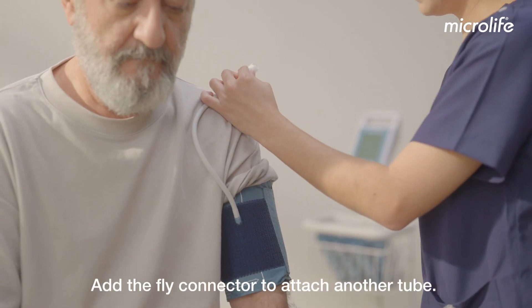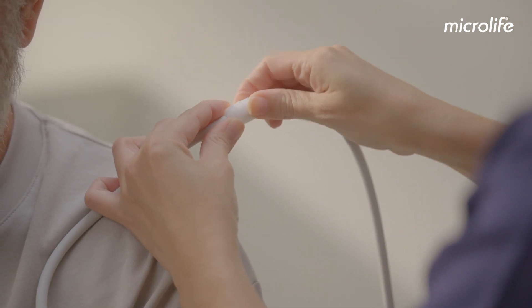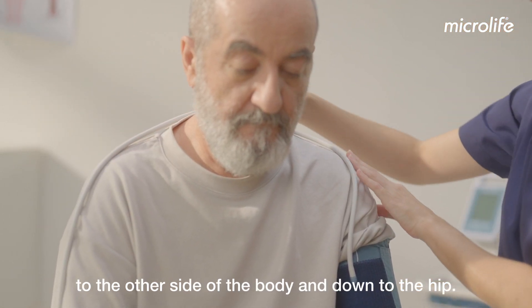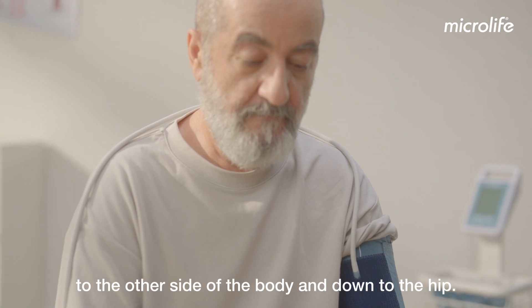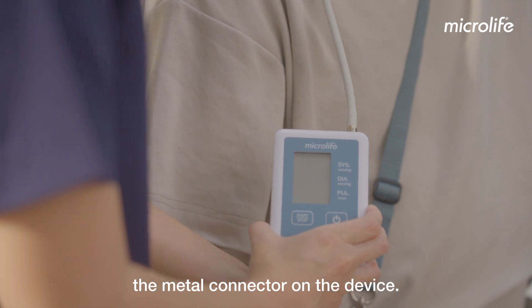Add the fly connector to attach another tube. The tube should point upwards and be mounted over the shoulder, to the other side of the body and down to the hip. Push the metal plug of the tube firmly onto the metal connector on the device.